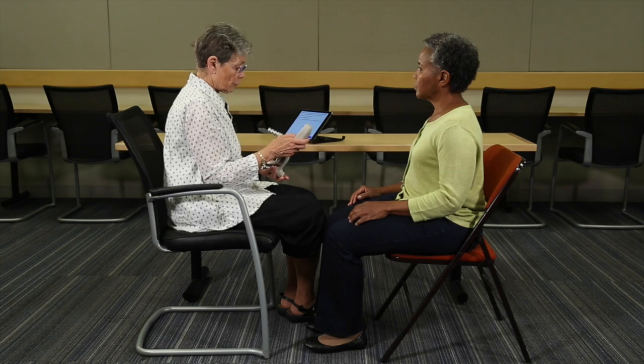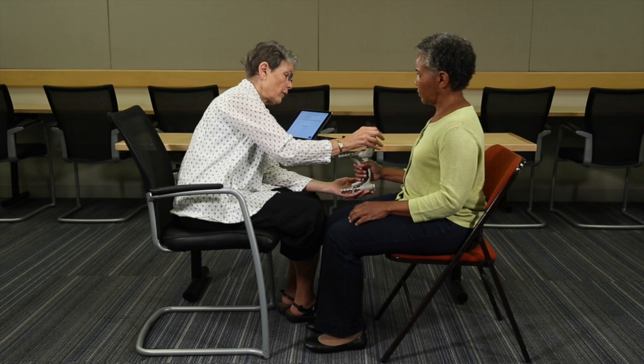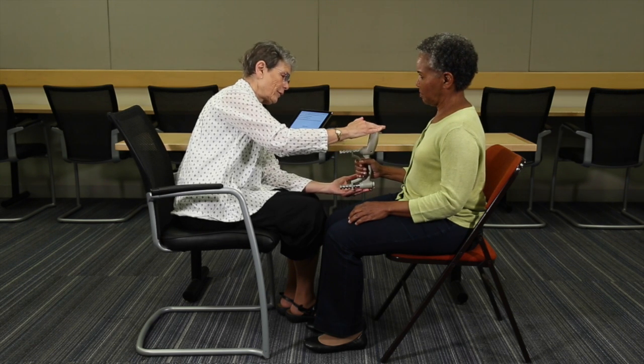Okay, and now we're going to test your right hand. Again, when I say squeeze this time, I want you to squeeze as hard as you possibly can. 3, 2, 1.